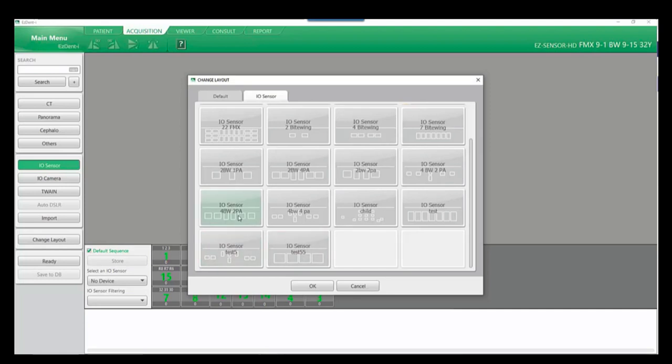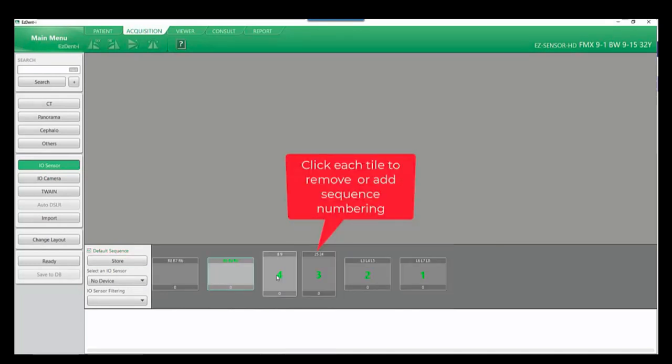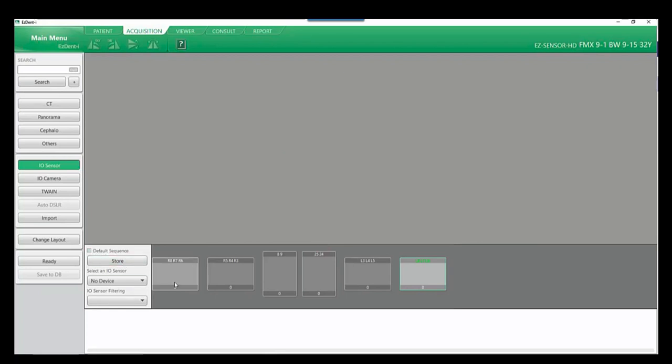Navigate to change layout and select the desired mount. Once selected, right-click and select OK. There are two workflow options: a default sequence and the ability to customize your workflow. If I uncheck default sequence, I can then deselect each tile number. You're now able to renumber in the order you would like to capture, and select store. This custom sequence is specific to the local computer where the changes were made.